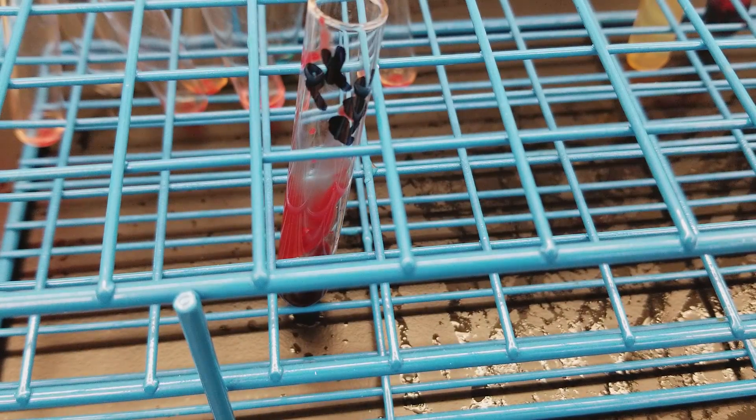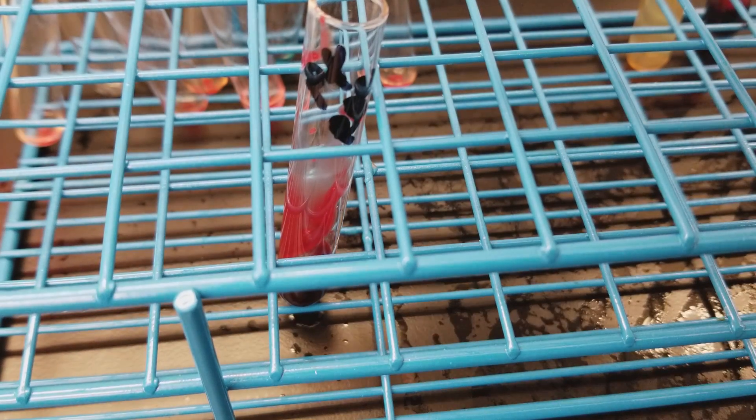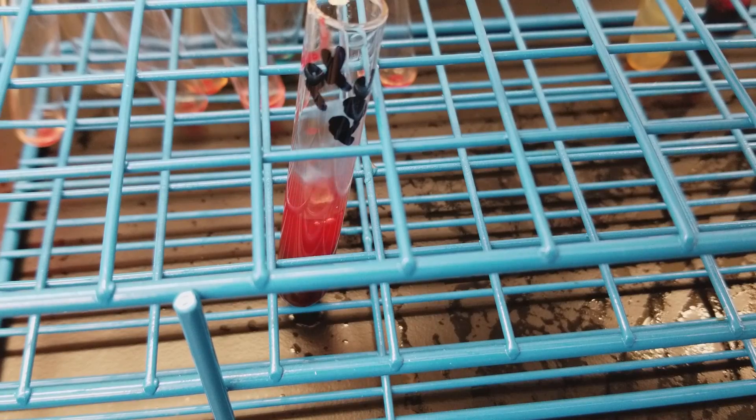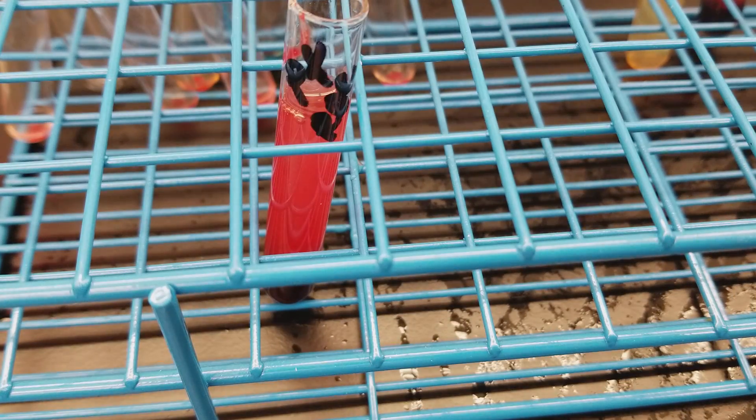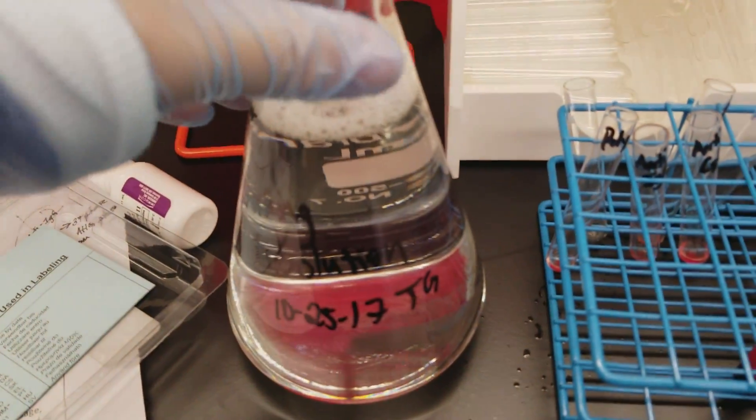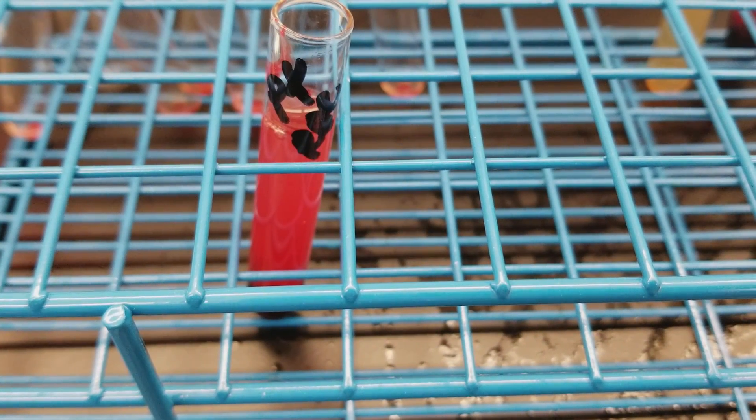Now what I'm going to do is first wash the patient red cells with saline, and then I'm going to wash them four times with the working wash solution that we prepared previously. I will put this into the serifuge and get back to you.